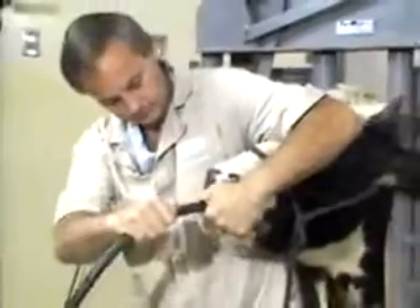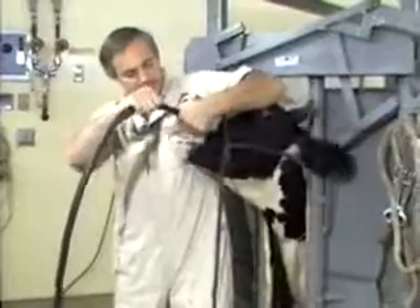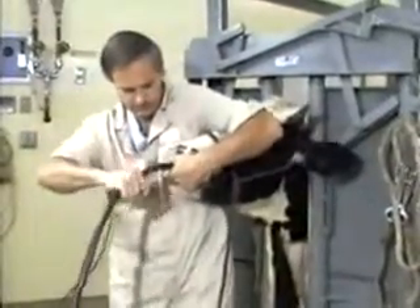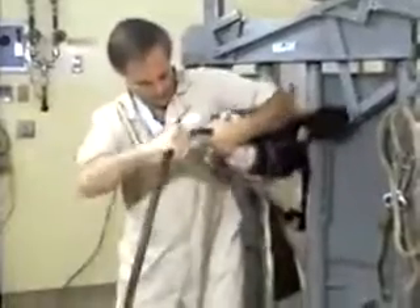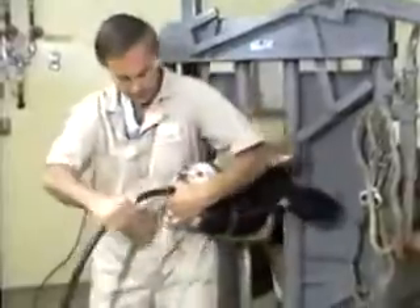At that point, we grasp the stomach tube and insert it, giving her an adequate amount of time to swallow it. Always make sure we have a hold of this rope so that she doesn't swallow the tube itself.